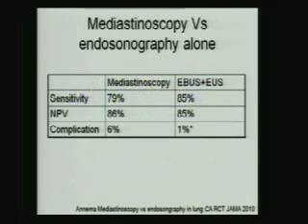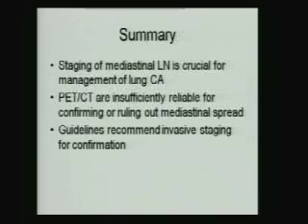When the combined modality, EBUS plus EUS, was compared to mediastinoscopy, the sensitivity was not significantly different, as well as the negative predictive value. The complication rate was higher in mediastinoscopy and lower in EBUS EUS.